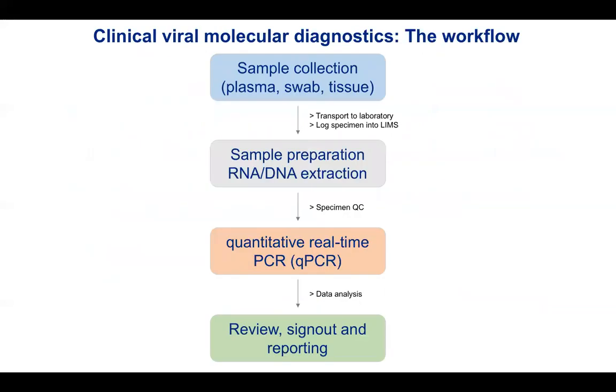This slide shows the workflow for clinical viral molecular testing. It starts with sample collection in the hospital, sample preparation in the clinical lab, viral testing using qPCR, and data review and sign-out.